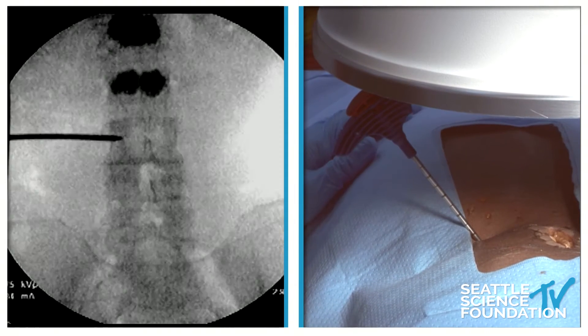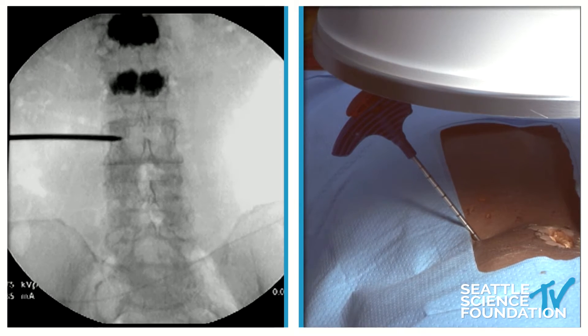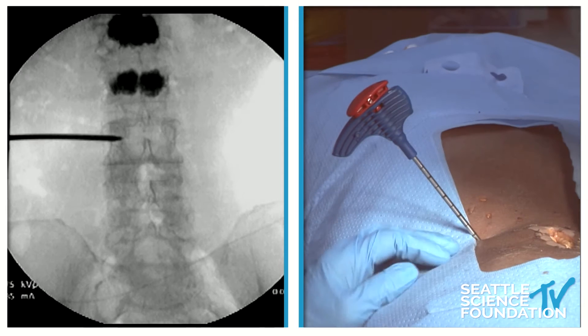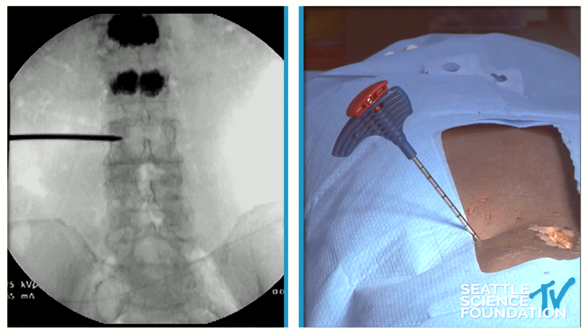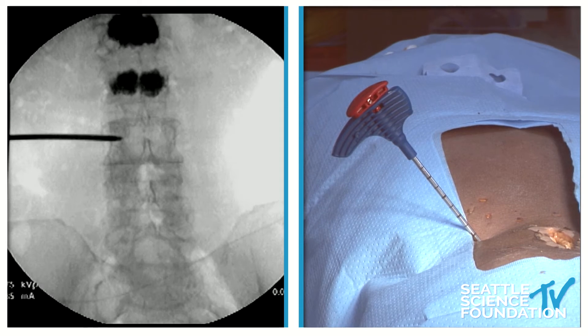Just by reflex, if we get down right there to the medial wall, we're right in the center of the vertebral body. Let's go back lateral. Then we're going to change this out for the stylet, and we'll make sure we're in the posterior portion of the vertebral body.